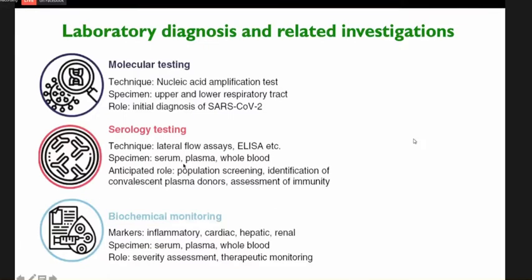While the serological test for COVID-19 is the analysis of the plasma or whole blood for the detection of antibodies, especially IgG, IgM, and IgA that are specific for SARS-CoV-2 antigens, including the spike glycoprotein and nucleocapsid protein. Testing methodologies in serology vary from rapid diagnostic tests, like the use of disposable immunochromatographic lateral flow assay, to ELISA or chemiluminescent immunoassay run by fully automated clinical laboratory instruments.